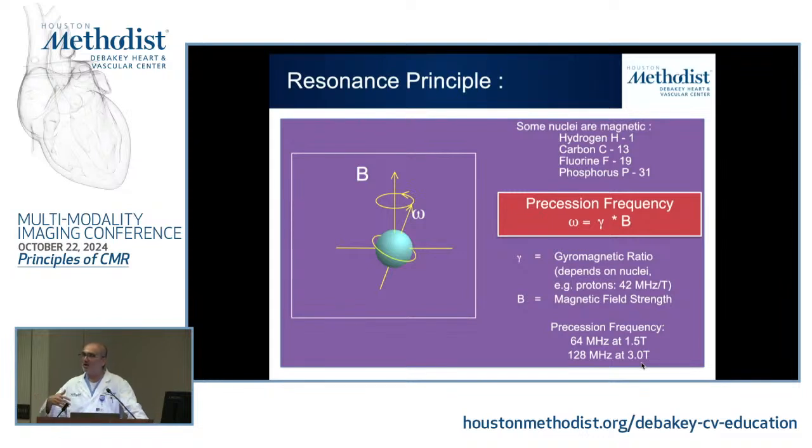But when you have all of your protons that speed up and align a certain way, a larger number, that certainly may have some local transient effects. So that's one of the things to be aware of. That's another reason why you're never going to see a 100 Tesla scanner. I think there are some physiologic limits that exist. But with the clinical ones that we use today, 1.5 and 3T, I don't think there's a difference.